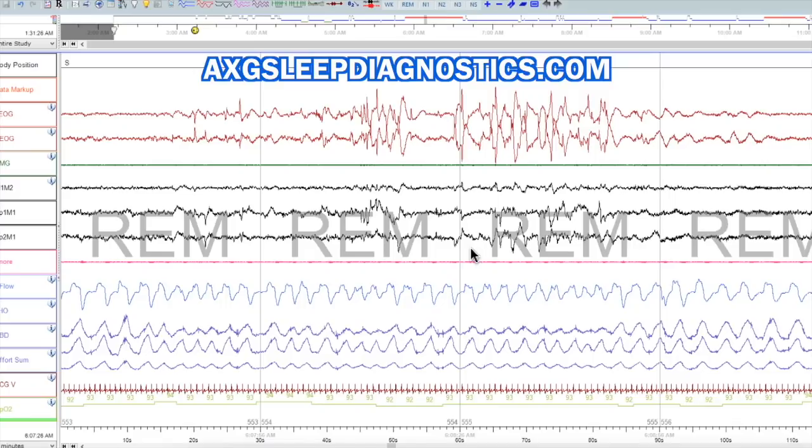Okay, this example I just wanted to show, a lot of people get freaked out because they see a lot of varying airflow. Now, one of the tricks that I personally use is I like to march out, and what I mean is I like to look out about an hour and a half, or 90 minutes. So you can see right here, we're looking at the top, this person, they're asleep right here. And then if you march it out to 4:30, it's about right here. So we should have seen a REM period.